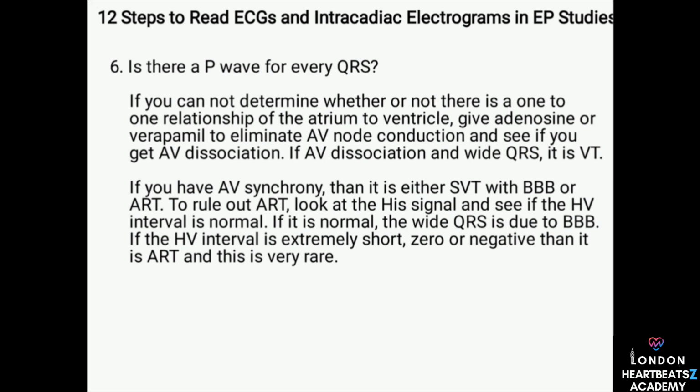Two conductors. That sounds like a recipe for disaster. It can be. Or we could be dealing with ventricular tachycardia, where the ventricles are just going rogue, contracting without any input from the atria. Like the percussion section decided to do their own thing, totally ignoring the conductor. Okay, so a mismatch between the P waves and the QRS complexes could mean a problem in the atria or a takeover by the ventricles.